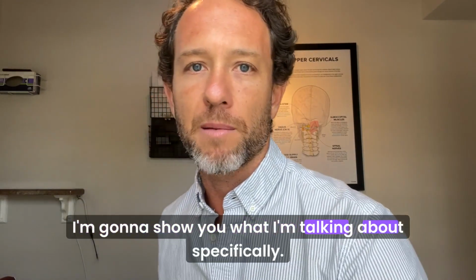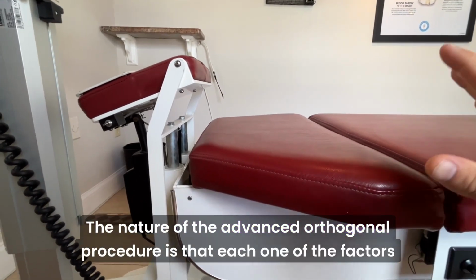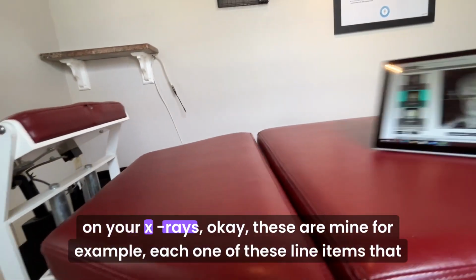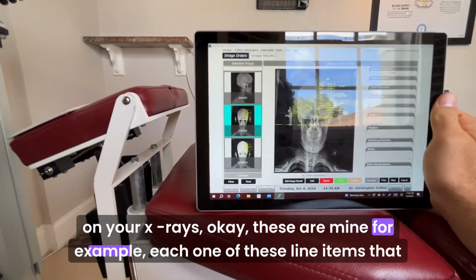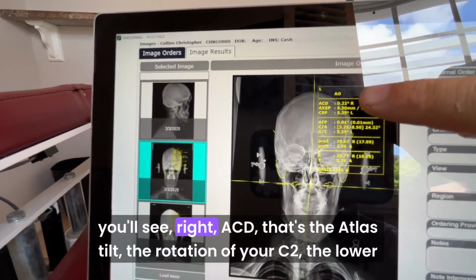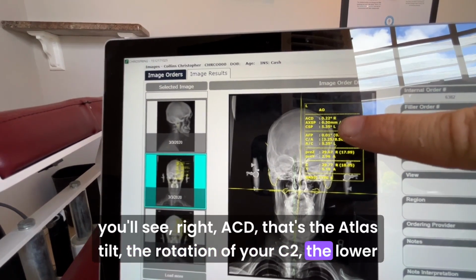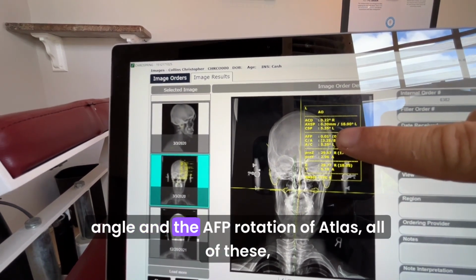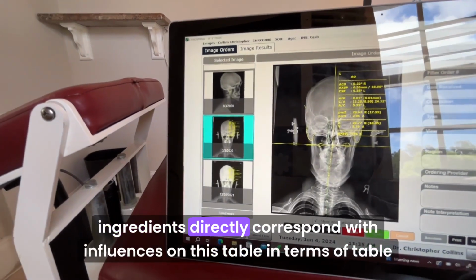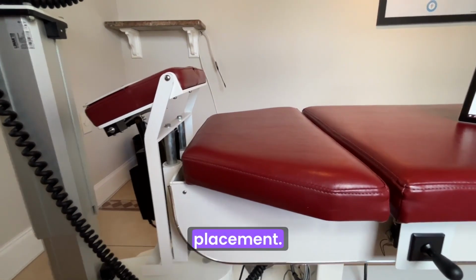So I have my table here. I'm going to show you what I'm talking about specifically. Let me get into it. The nature of the advanced orthogonal procedure is that each one of the factors on your X-rays, okay, these are mine, for example. Each one of these line items that you'll see, right, ACD, that's the atlas tilt, the rotation of your C2, the lower angle, and the AFP, rotation of atlas, all of these ingredients directly correspond with influences on this table in terms of table placement, right?